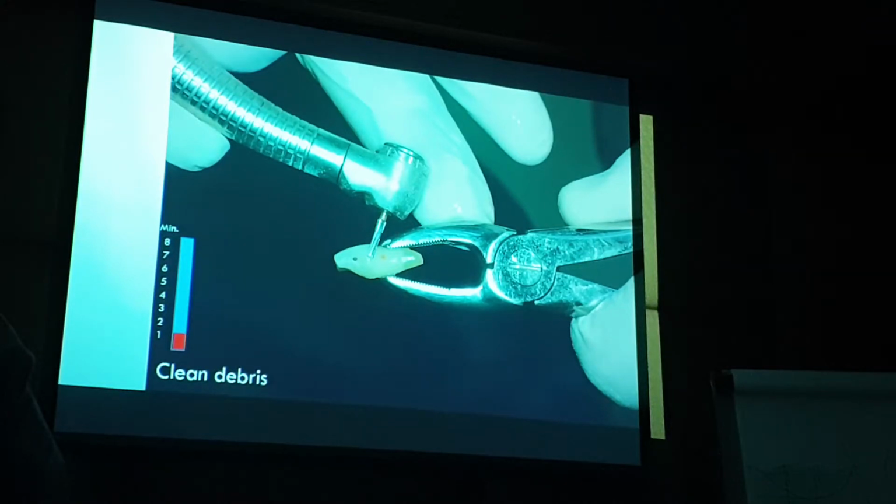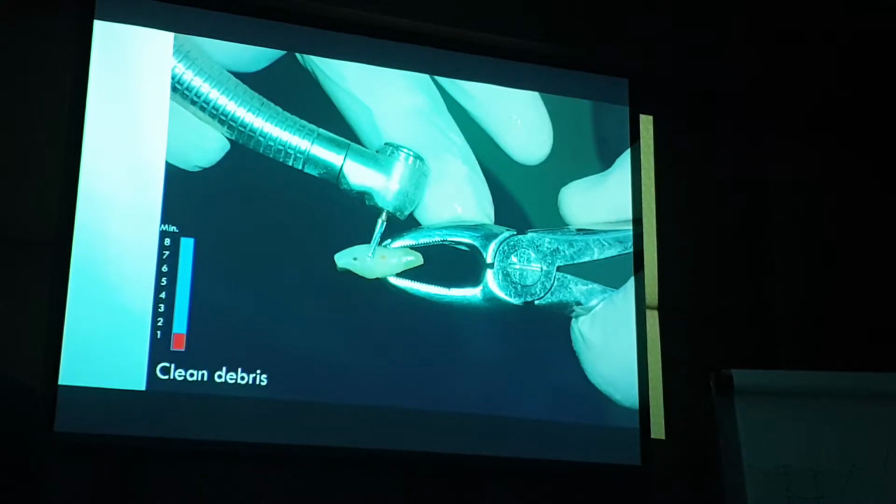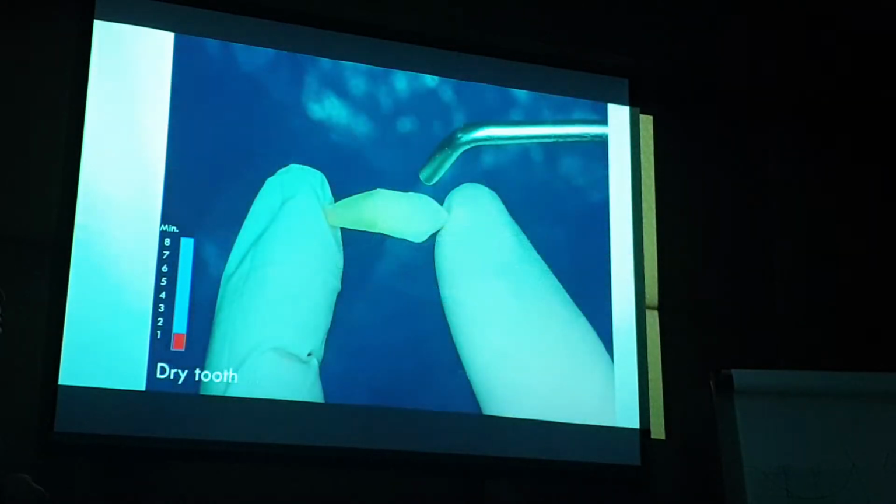I also remove the enamel, so we're just down to dentin. Any restoration, any enamel, and then we just take the burr and literally clean off any of the dentin that's exposed, any cementum that's exposed, because that's where all the biofilm is, down to good, solid, healthy dentin. Then we put it into the grinder, we dry it off, that's what's left.